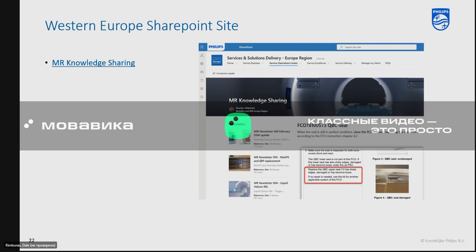If somebody's contracted by Philips to work on a system, it makes sense to me that we give them the tools that they need to work on the system. And I'm going to raise this up as a question to somebody. I'm not sure who, to find out more about that. Because I was also going to share the link to the Hamburg tool, and that does require a code 1 identification to get access to. But it's the most useful tool that we have. So I take your question, and I realize it needs to be answered in a thorough way by somebody that's a higher pay grade than me.